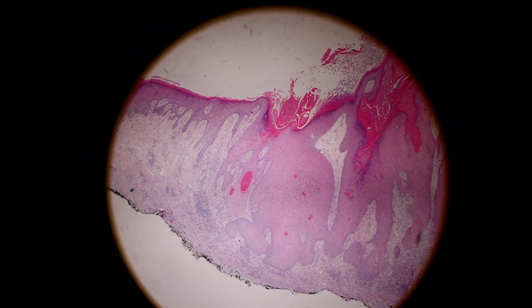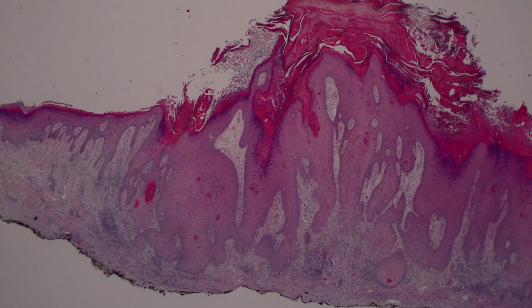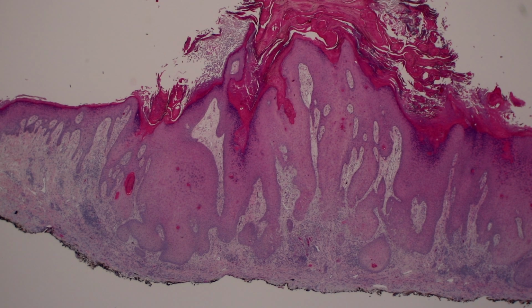I think in reality I actually just called that case squamous cell carcinoma, but it's one where it's worth thinking about. If you're not sure, the way to deal with it is to use some comment about your uncertainty, and then help your dermatologist know what you'd like them to do.